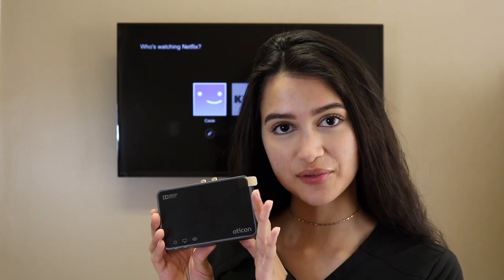Hello Thrive family and welcome back to our YouTube channel. I hope you are all doing well. My name is Angie Rosales. I am a patient care coordinator here at Thrive Hearing and Tinnitus Solutions, and today I'm going to show you how to connect your Oticon hearing aids to the Oticon TV adapter box.